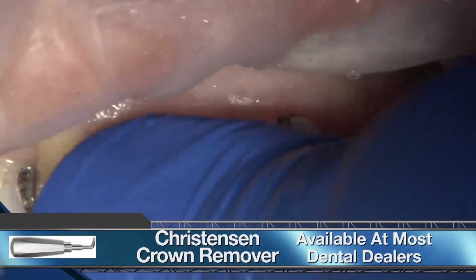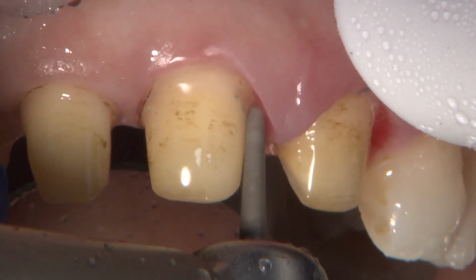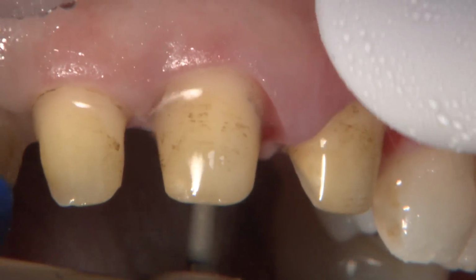Crowns came off pretty easily when I used the Christensen crown remover to expand the vertical opening. We can see there was some stain on number 7 where there was an open margin, but the preps have a fair amount of tooth structure left and there is no decay.